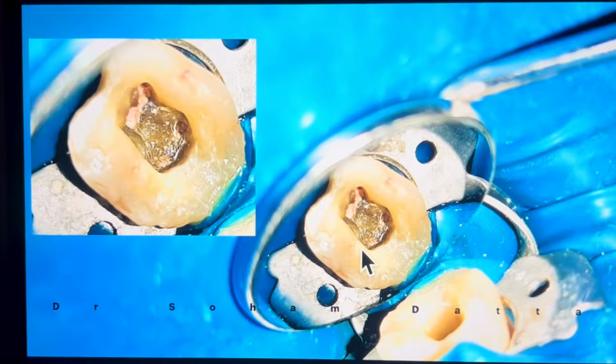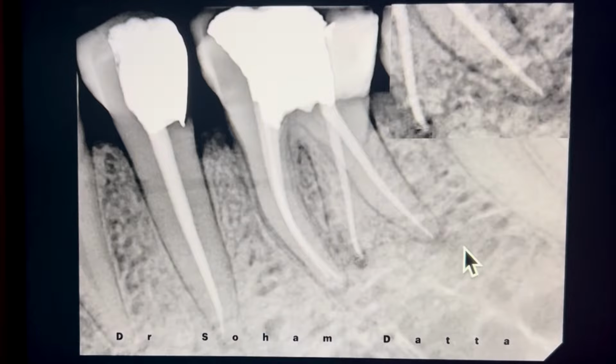Now this is the picture of the access cavity after the obturation. So I removed the pulp stone with the help of the ultrasonic. Here the distolingual GP, distobuccal, mesiobuccal GP, and the mesiolingual GP. Now this is the X-ray after the obturation.